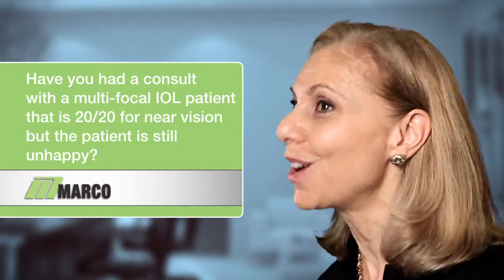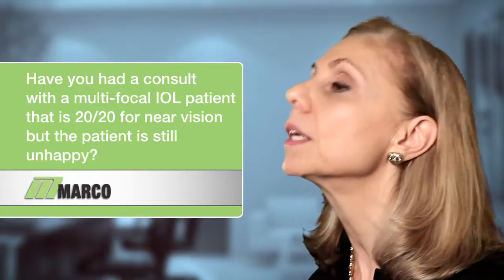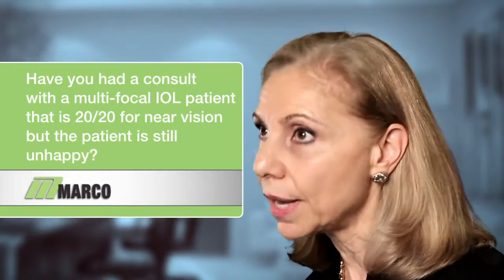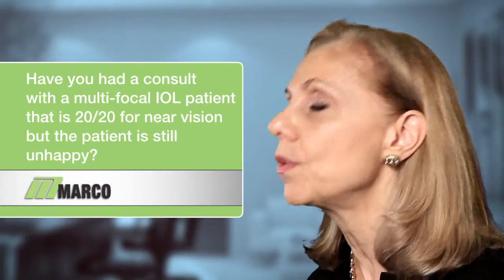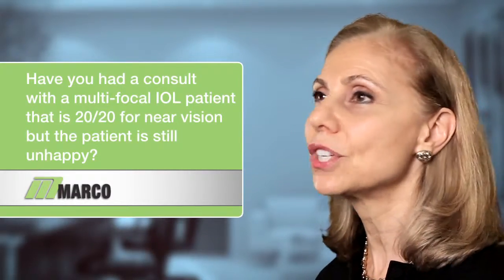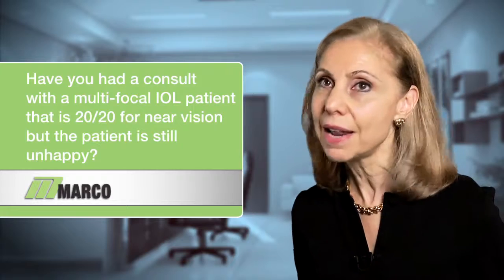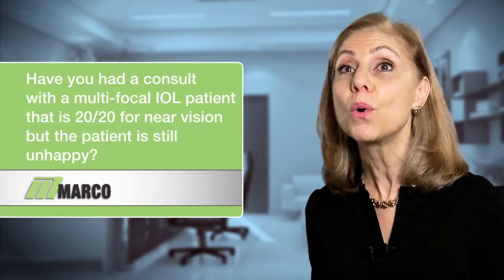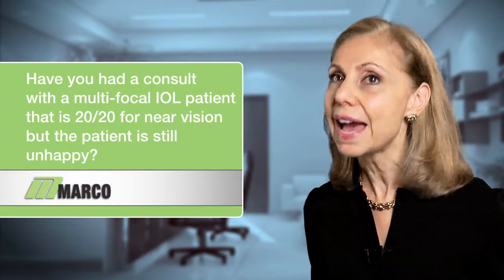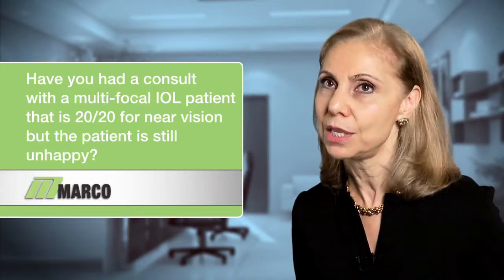After a lot of speaking with her and explaining this to her and showing her the maps on a large monitor in the exam room, she understood what was going on. We agreed to go ahead and do an IOL exchange, take out her multifocal and put in a monofocal, and after that, she said her life went back to normal. What was surprising is that in her fellow eye, she did not have a positive angle kappa. So she was not unhappy with a multifocal in that one eye, yet her angle kappa was so large in her second eye that it led to these problems.